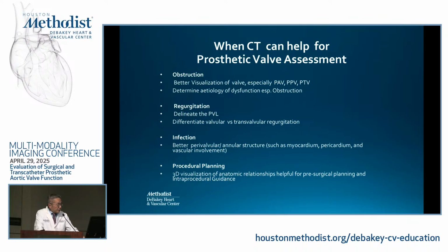For infection, again, it's very useful. Not so much to see the vegetation, because our temporal resolution is bad, and we almost never see small vegetations. I think the sensitivity is about 30%. But it's critical to see the involvement of the paravalvular tissue to plan for the intervention, mostly surgery.